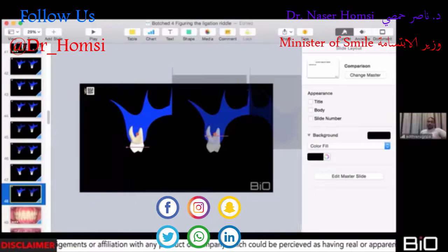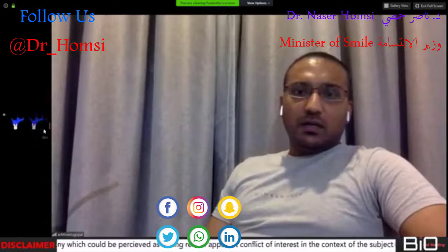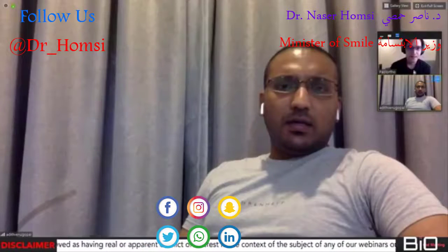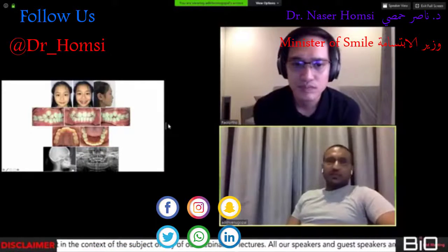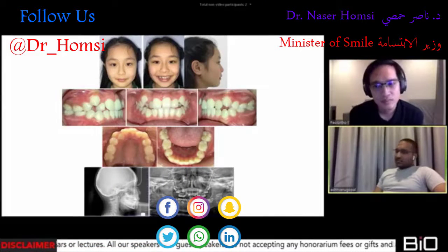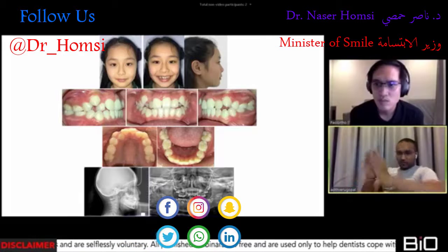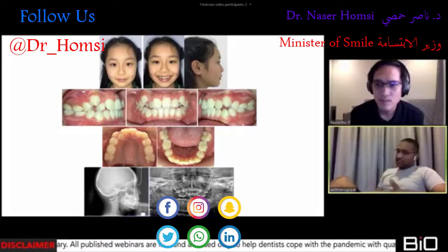Yeah, that's pretty interesting. But the hard part with what you showed is getting to the point of force application. Don't you think so? Yeah. Because we're nowhere close to the center of resistance. And it's very hard to generate forces at that level, especially from the palatal side, because all our appliances are buccal. So it becomes very hard to generate that amount of force from the palatal. If we are successful in generating forces from that aspect, I'm sure the entire game would change.